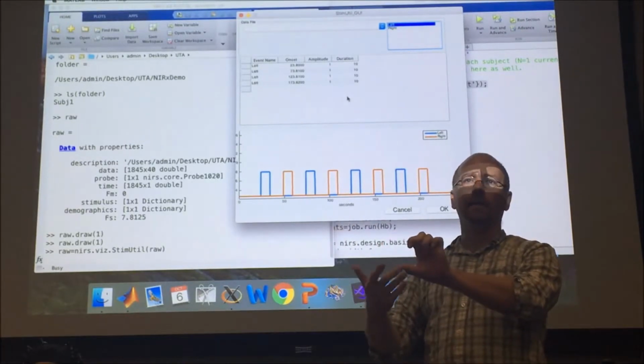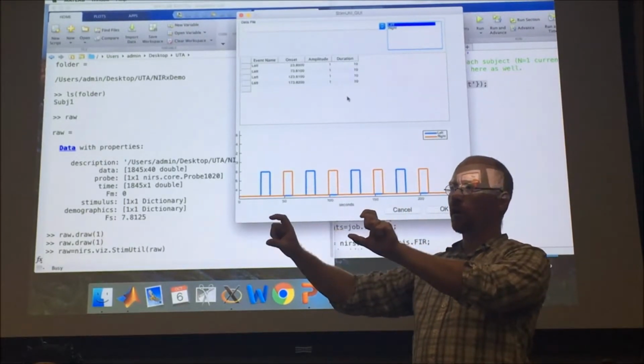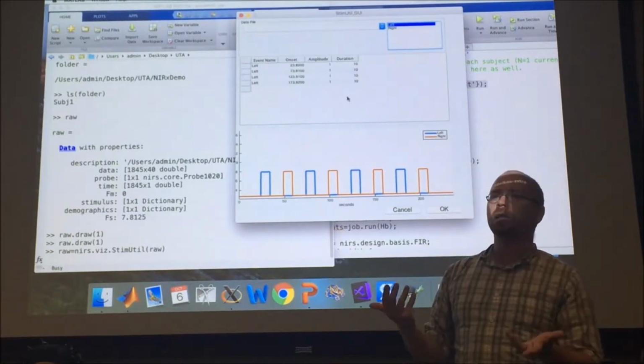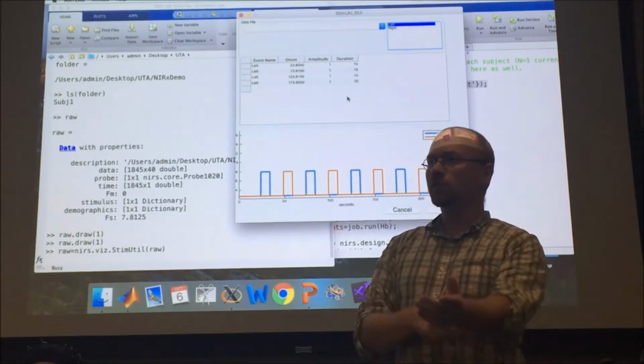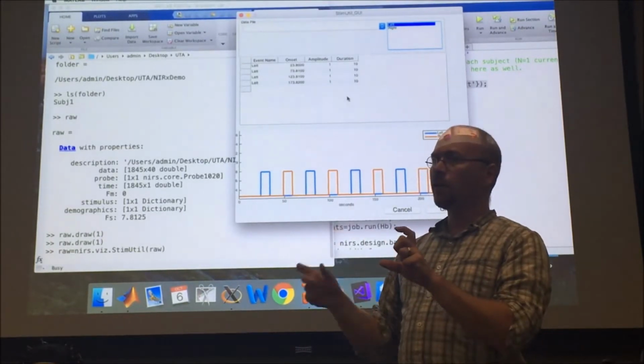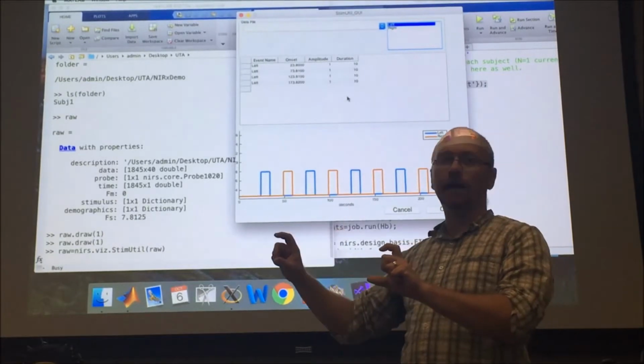So I'm modeling my data as the sum of these 2 conditions. The first one, the one that's constant for all blocks, is going to find brain activity that didn't care about reaction time. So it's going to find brain activity that was the same every time I did it. The other one is going to find brain activity that was changing with reaction time.